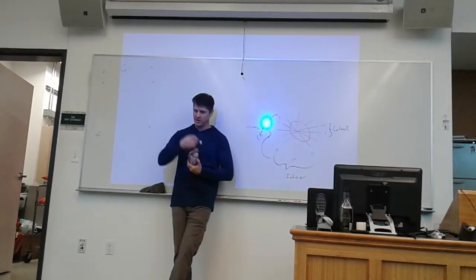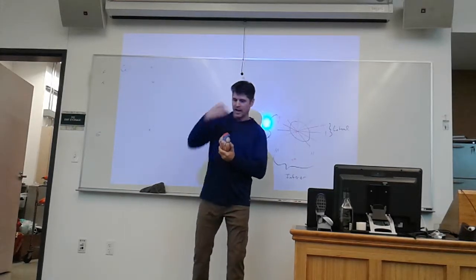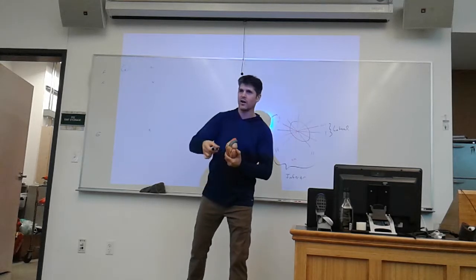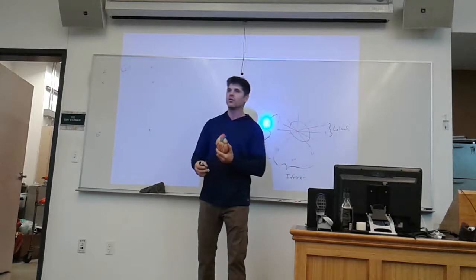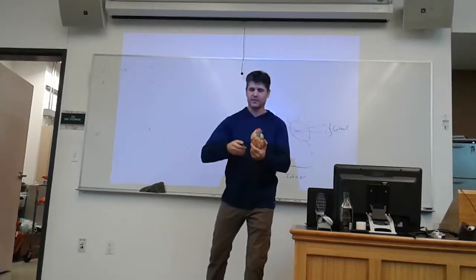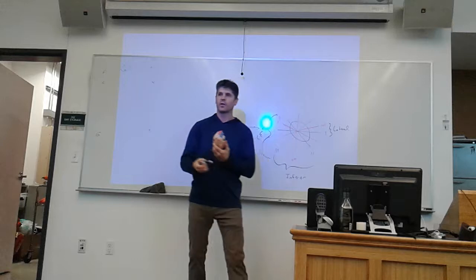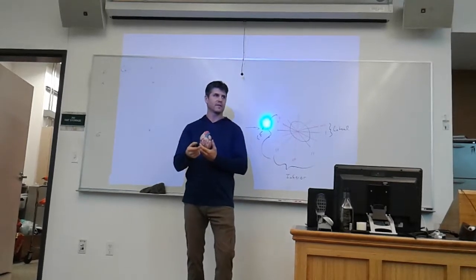That make sense? We just were in this plane, the coronal plane, and now we're in the transverse plane, going this way around the heart. Because we're trying to get a three-dimensional picture, right? We now know what's happening this direction in the heart, but we don't know what's happening this direction with the heart. And that's where the precordial leads come into play. Does that make sense?